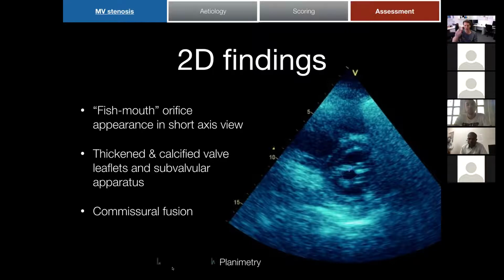Can you bag out the picture that I've taken here? Can you tell me some good things I've done and some bad things I've done on this picture? So look, if I was going to take this measurement, you'd want to alter your depth settings and your sector settings so that you've got the best possible image. And you would want to zoom in probably on the mitral valve orifice as well in order to maximise it. Would it be reasonable to say that would improve your temporal resolution as well as your axial resolution? So if you're zooming in, just focusing on one area, you could have better temporal and axial resolution.